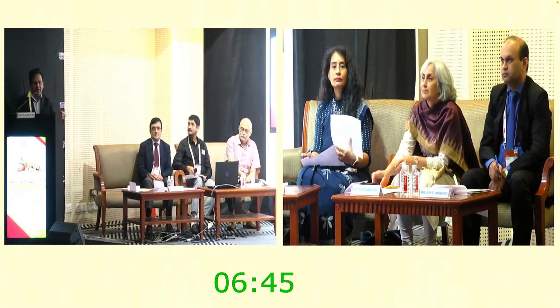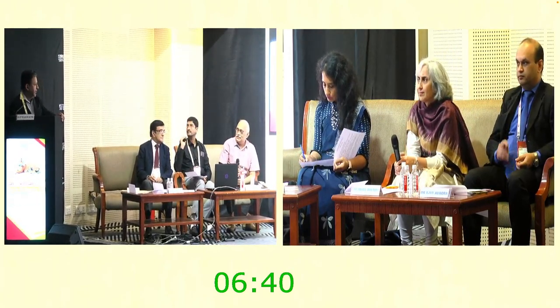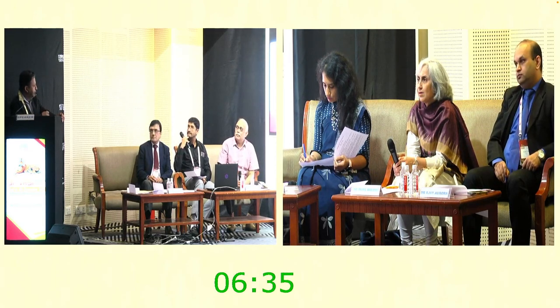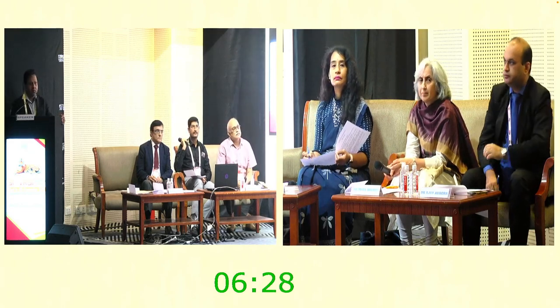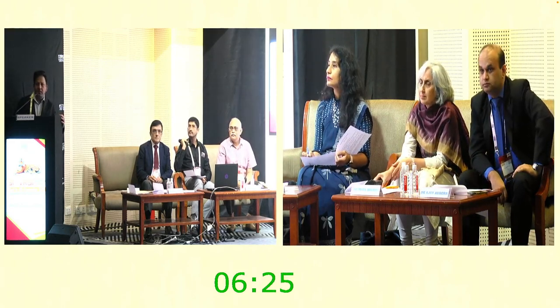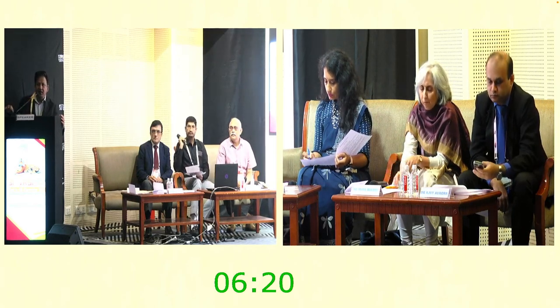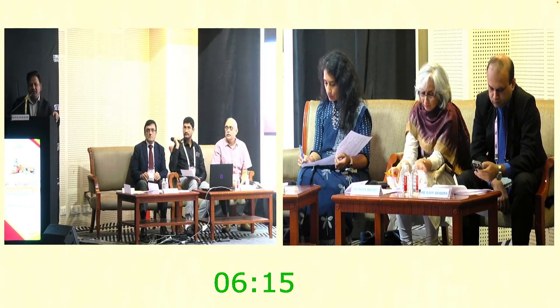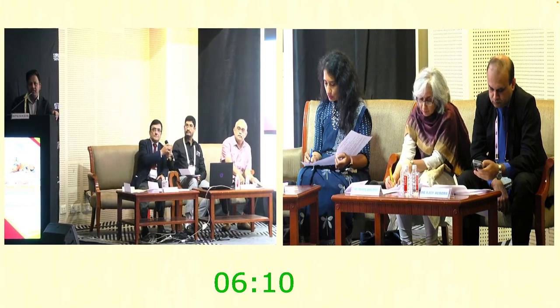The tears can happen anyhow using whichever instrument. The bleed can also be taken care of if you attach it to the infusion pump. At the same moment, you don't have to come out and introduce another instrument. Would this be stiffer than the needle, just to prevent unintended movement? Yes, it is more stiff, sir, so that we can prevent unwarranted or unexpected movements and traction.